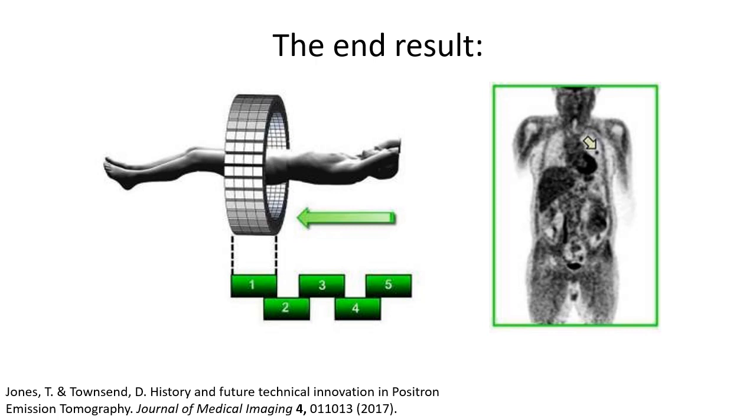Doctors and physicians can look at this and identify key organs in the body where glucose is supposed to be sent, and can also identify abnormalities and locations where high levels of glucose are showing up that shouldn't be there. An example of this is this little black speck on this example PET scan that the arrow is pointing to, which would be a high probability of being a tumor if it weren't some other organ.